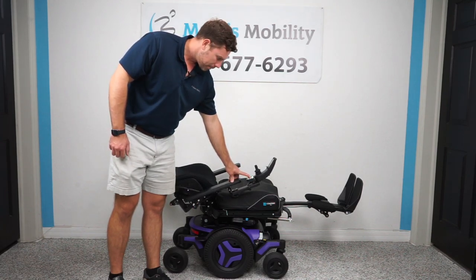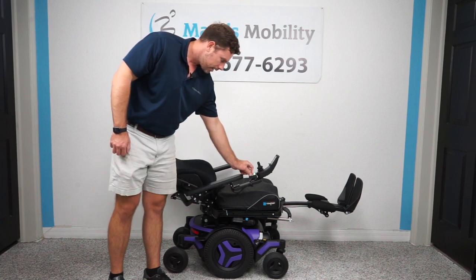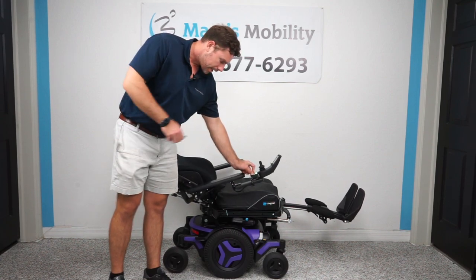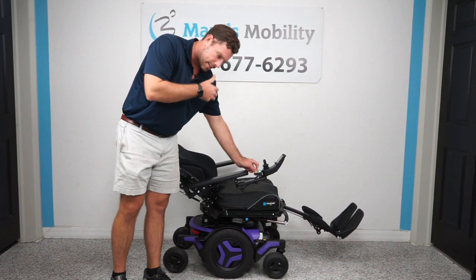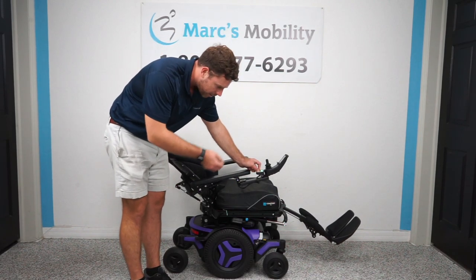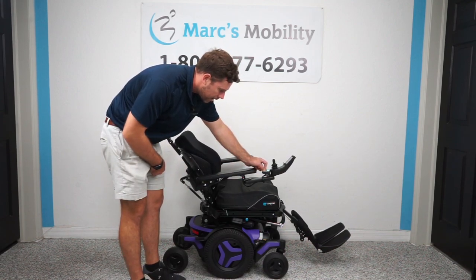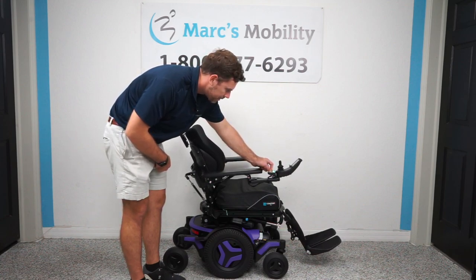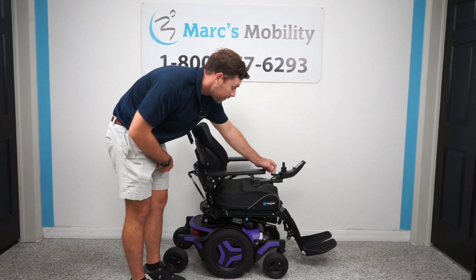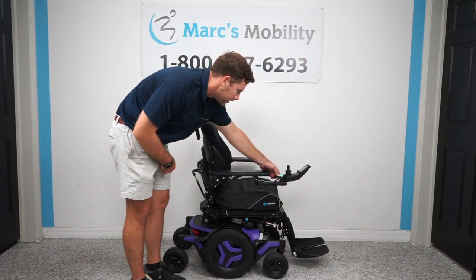Permobil is one of the most dependable chairs on the market. There are so many different things you can do with this chair. We can adjust the color and the seat size, and we can also add on many different accessories such as lateral guards, attendant controls, trays, and light kits. If there's something you don't see that you want, let us know because we can fully adapt anything to your needs.